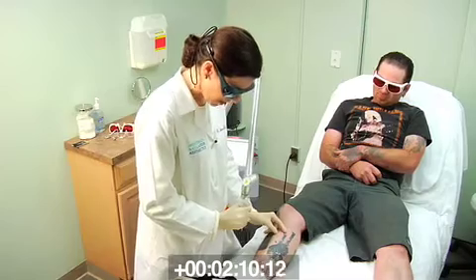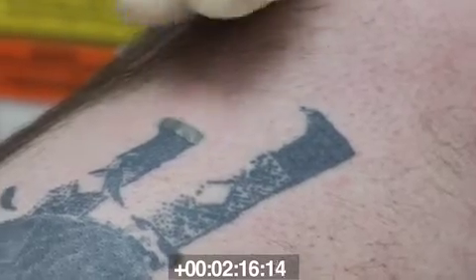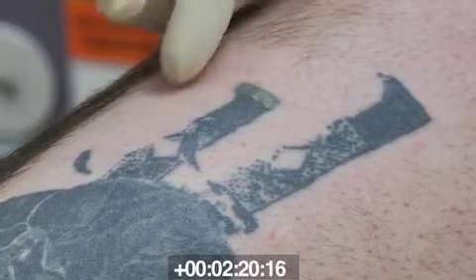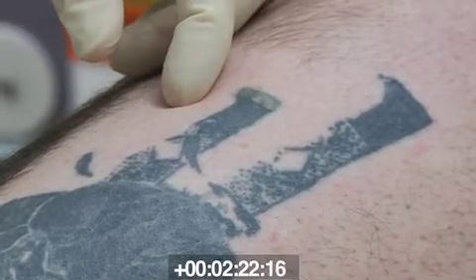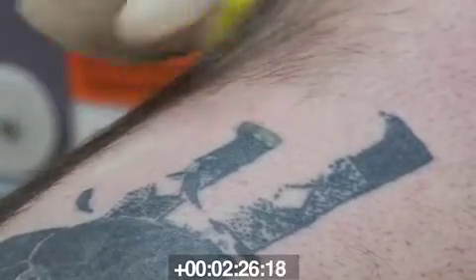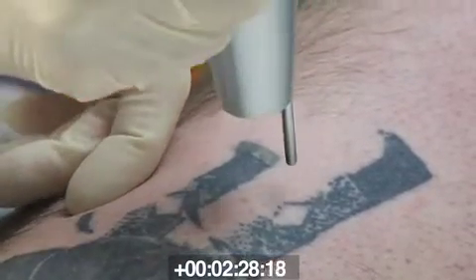This crisp white spot is due to, when you look histologically in the skin, immediate vacuolization, and it dissipates almost immediately. So the whitening that occurs with tattoo removal treatments does not stay, and you need to inform patients of this because they think that you've immediately removed their tattoo and you have not.